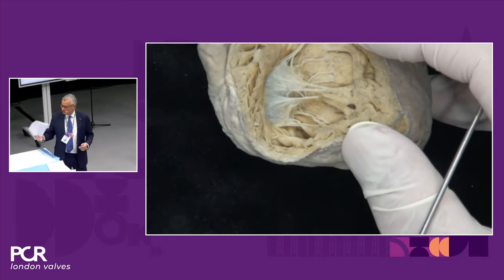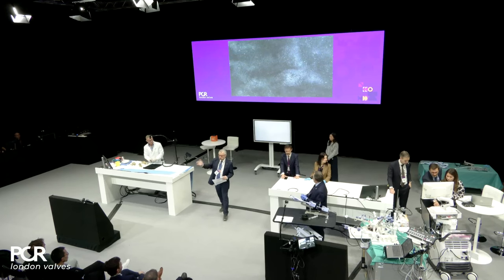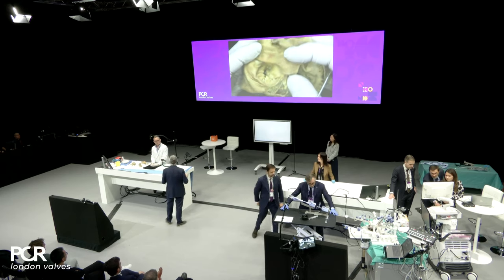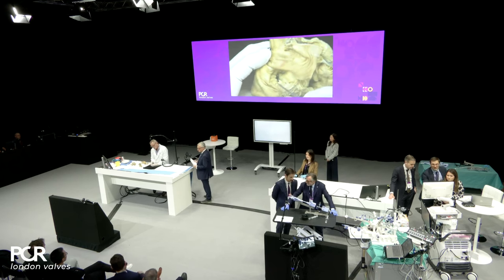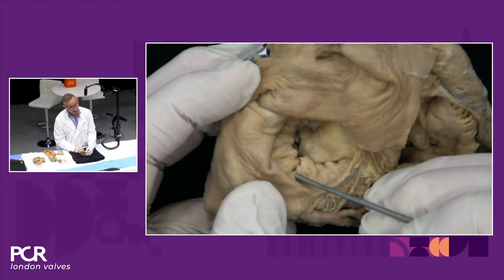All right, but let's go back to the mitral. I apologize for jumping, but it was a good question. So this is an ischemic MR. I'm going to show ischemic MR in a moment. I'm just going to show you the mitral from the atrial side first of all, because I want to focus on the P2, P3 area.